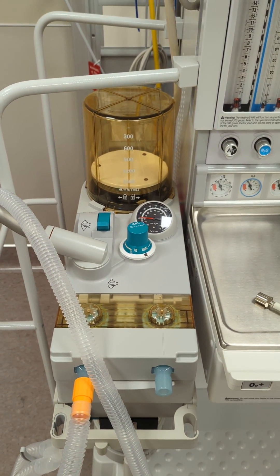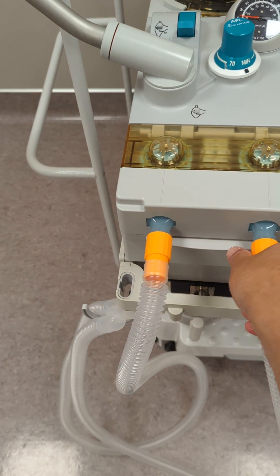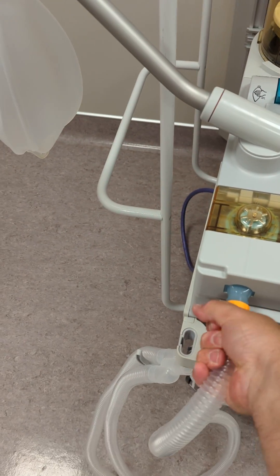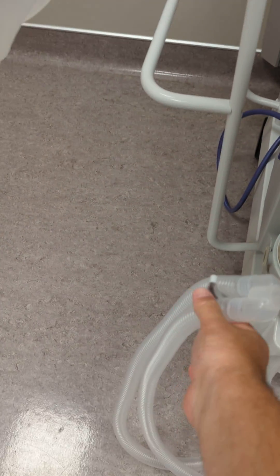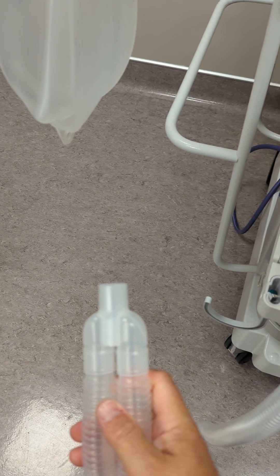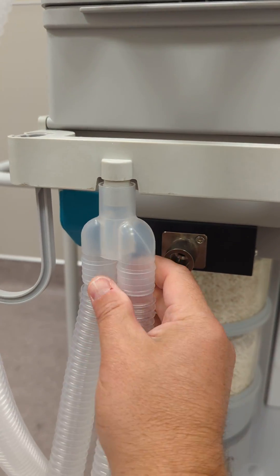Now the second test is the circuit leak test. So reconnect your expiratory limb. Ensure your inspiratory limb and your reservoir bag are in fact secured. And then your Y can actually be blocked off on the front by this nub here.